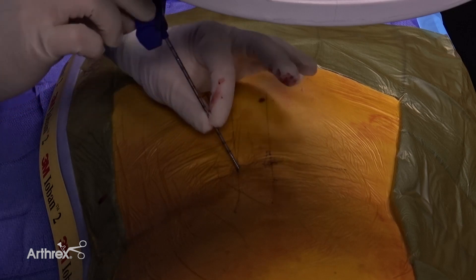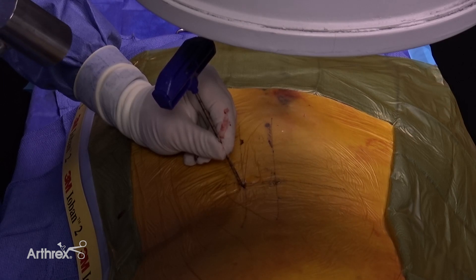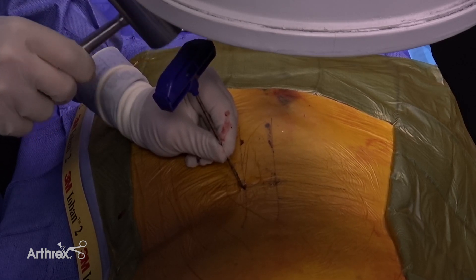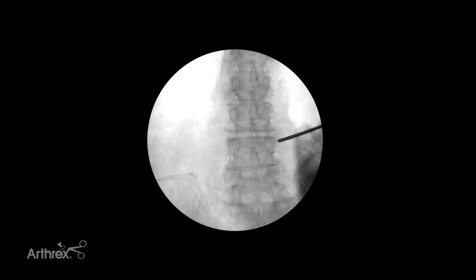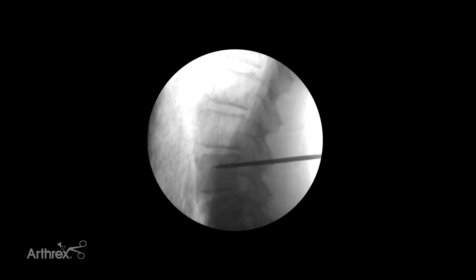The needle is then placed into the incision using fluoro to guide the location of the needle to the pedicle. Fluoroscopic shots are taken until the tip is aligned over the top of the pedicle and the proper trajectory for the needle is achieved. This is advanced on the AP fluoro shot to the medial wall of the pedicle. The C-arm is moved into the lateral position to determine the depth of the needle within the vertebral body, which should be in the posterior third of the body. The needle is then advanced so the tip is in the anterior third of the body to prepare for aspiration.